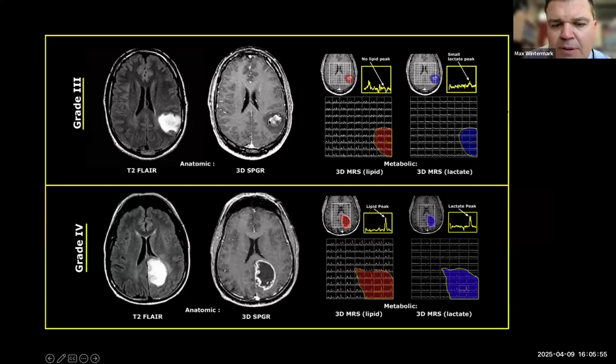The other thing that you have to be very careful about is that if the region you are interrogating with spectroscopy contains any water or fat, it is going to completely throw the process off, because the signal from the water or the fat is going to completely overwhelm the signal from those rarer metabolites that we're interested in. And so typically when we do spectroscopy, we carefully position the region we're interrogating, either the single voxel or the multiple voxel, to try to avoid any contact, mostly with the fat located in the bone marrow.